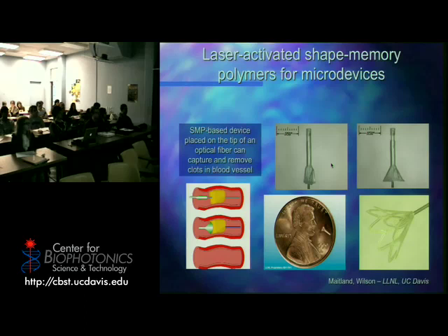Okay? Question? Yes? How do you tell when you're through the clot? Well, what they do here is they do a very, very low energy X-ray, like a continuous imaging. And that's also how they know where to snake through. So they can see the clot because they put a dye into the blood, and wherever the blood isn't flowing, it goes dark. You can't see there. So they can see it. It goes up to here, and it should be going further, and it doesn't. So they can push that through and then pull it out.